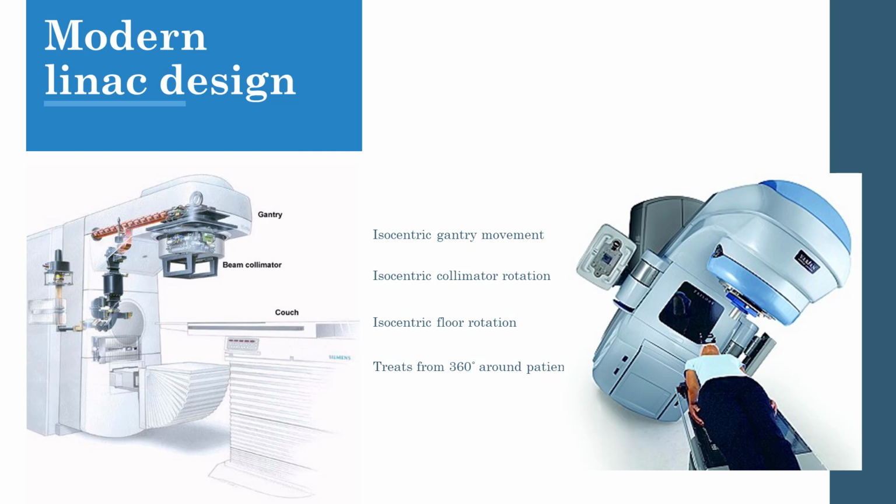These were quite limited as they could only take images with MV beams, which limited their quality and only at the angle of the machine head. However, this was a vast improvement on the previous checks, which involved port films on a stand, angled correctly manually to capture an image. These were then exposed and checked.